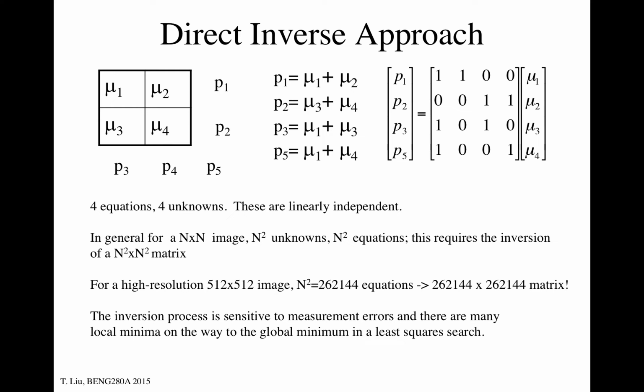This becomes an enormous matrix, right? It's obviously n squared by n squared, that's how many dimensions you have in this matrix. So that's a lot of equations. It doesn't really work that well because of the instabilities in doing that kind of inversion. Who knows?